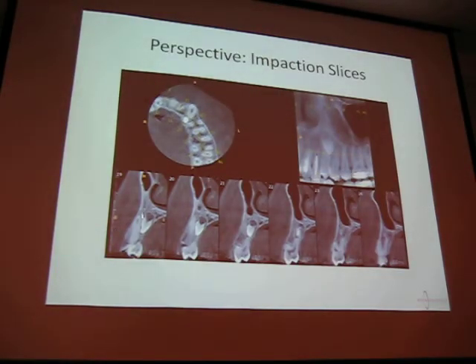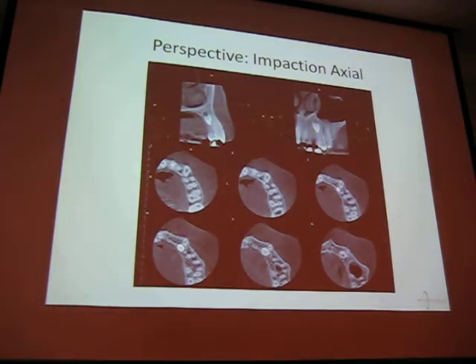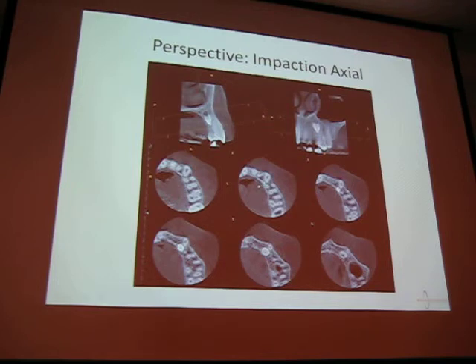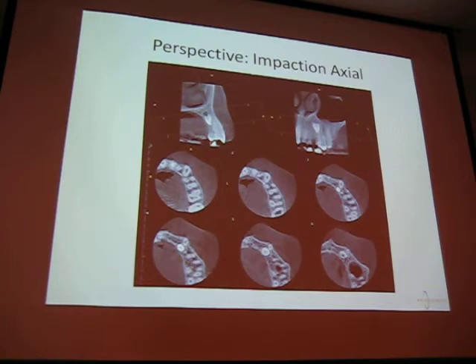Talking about impactions — we're doing these slices, but I find it more interesting to go axial from the top down. Because the question is: how are we in communication with an adjacent tooth? Can you show me where? We're able to slowly go down and see that. Again, just something you don't get from a PA.